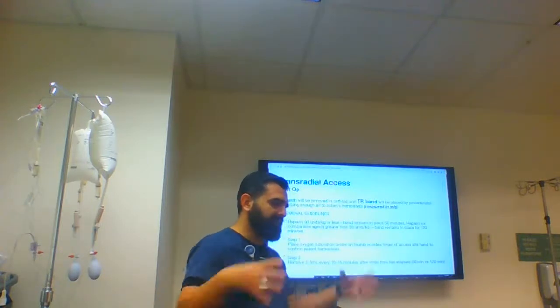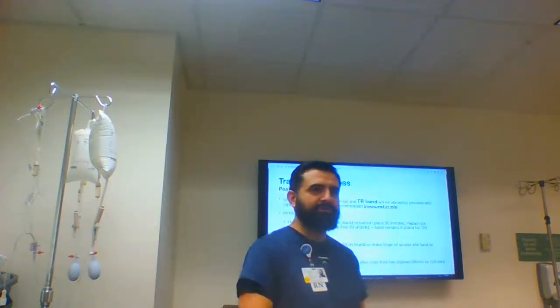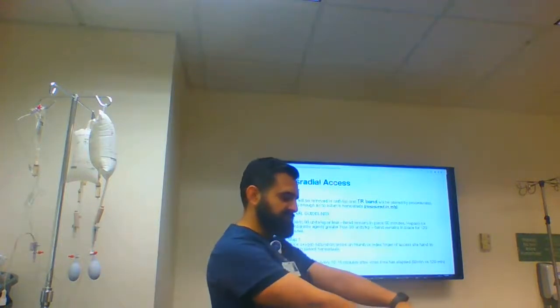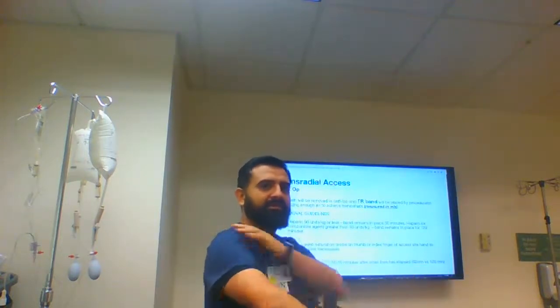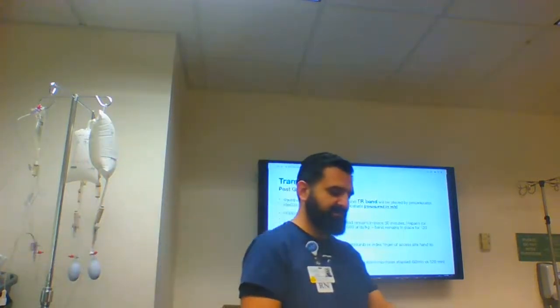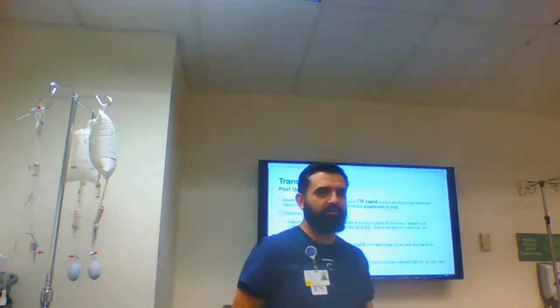What do y'all use? Just a regular radial splint immobilizer? Yeah, it's literally just a little board with 2 Velcro straps. It's not like the A-line one or anything. It's just rigid, and just for the forearm. It's just from here to here, about 10 or 11 inches long. So if you have a giant hand, it's only for your hand, and if you've got little baby arms, it's half of your body. Very simple. And we try not to get it dirty because we send them home with it too.